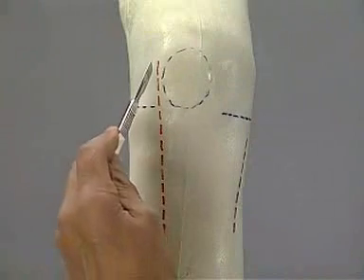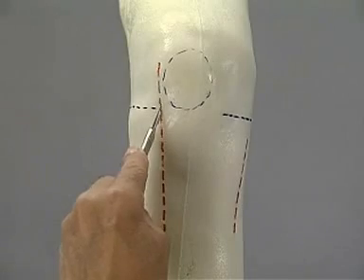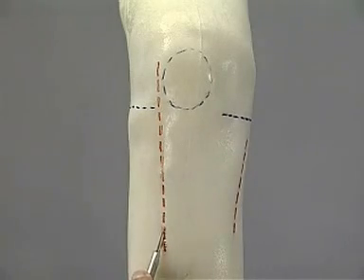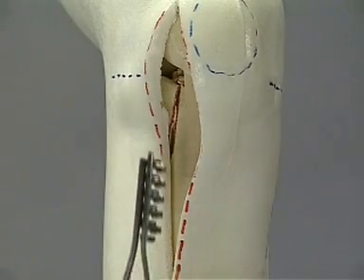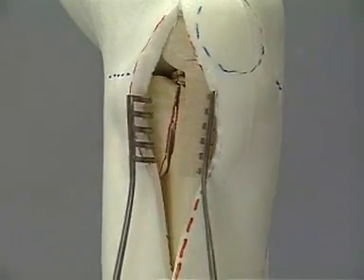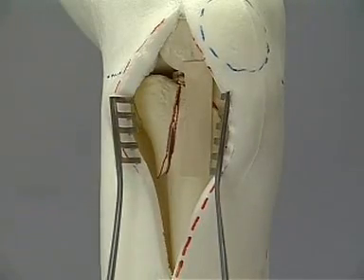For the approach, we chose a straight incision running laterally to the patella and tibial tuberosity. We proceed rather directly down to the bone without separating the different layers too much. The knee joint is opened via a horizontal arthrotomy distally to the meniscus. If the meniscus is avulsed, it is advisable to place two to three resorbable sutures into the rim of the tear for later reattachment.